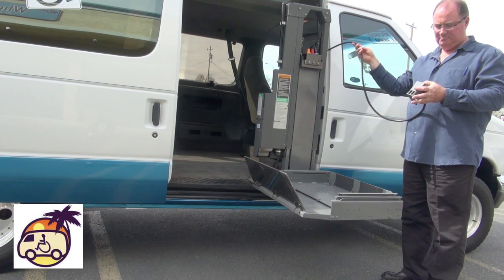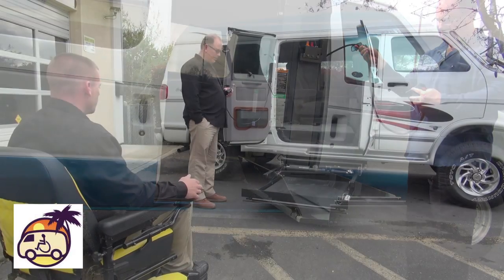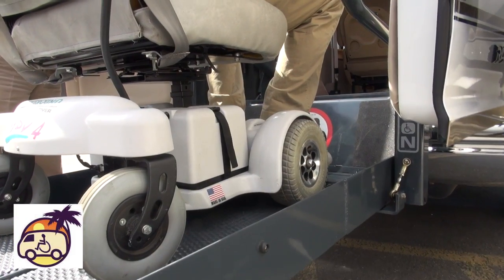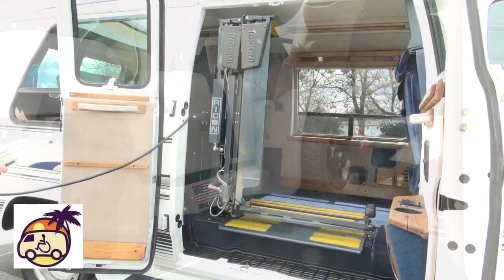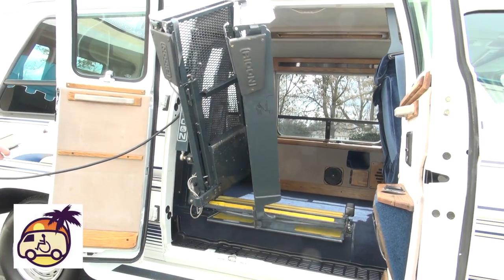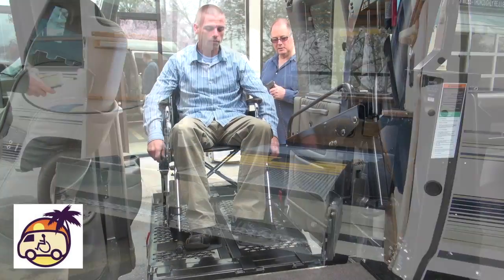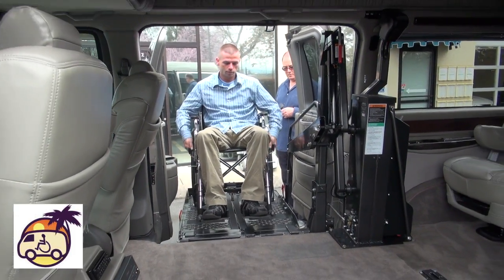There are some lifts that vary from these numbers, and there are a couple of very unique styles of lifts that don't fit with what I've described here. But this information applies to about 90% of the lifts built from around 1990 and well into the 2000s. In the later 2000s, there started to be some lifts with higher ratings, but if you're looking at affordably priced wheelchair vans, what I've talked about here definitely applies.